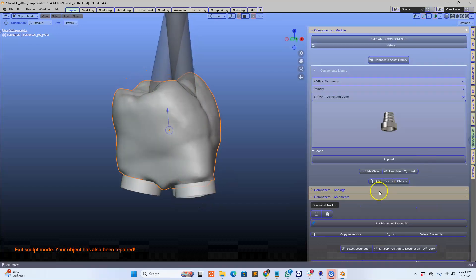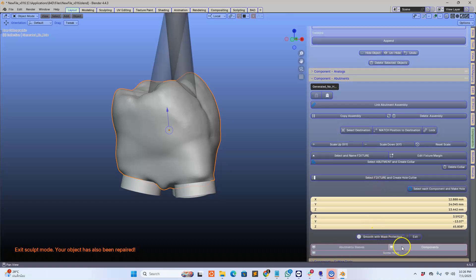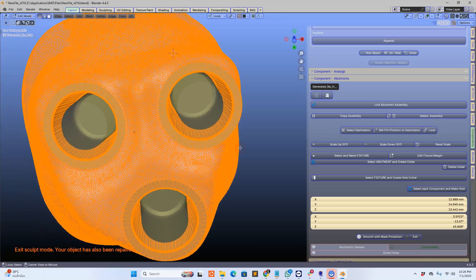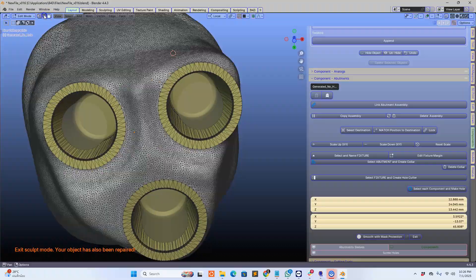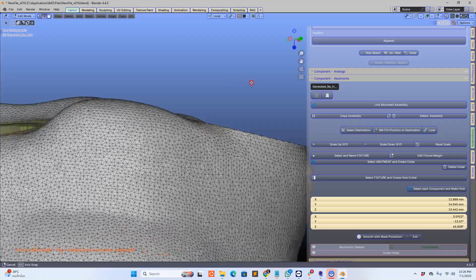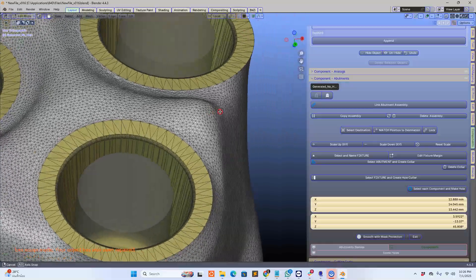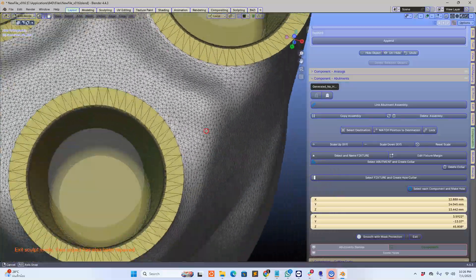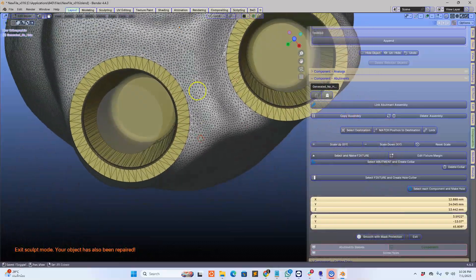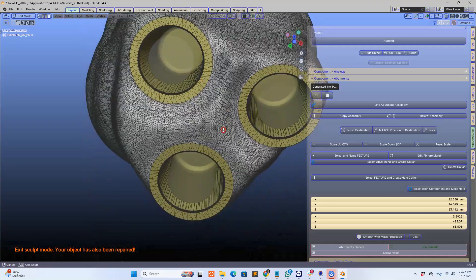I'm just going to hide the components and show you what it actually looks like underneath. In edit mode — this is the quality of the Blender 4.4 dental mesh structure. It's not even competition to the other dental softwares. We've got an absolutely perfect mesh structure which you can't really criticize at all.